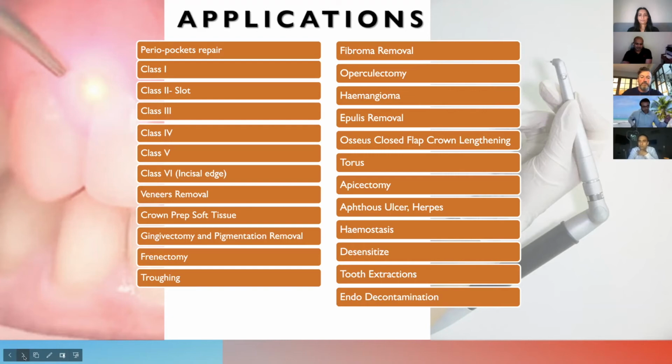They're extremely selective, and the non-selectiveness comes in our head because of the amount of years that we have been using drills and scalpels. We perceive that as good because we are always very careful and vigilant about what we do. But when we use dental lasers, the good thing is you choose exactly what you are using it for, as on the screen that I showed you, and that power is used for that. Its cutting power is only at one centimeter from the point of delivery. Anything beyond one centimeter, the light starts to spread, so the power, which was very strong here, has suddenly become very weak outside.